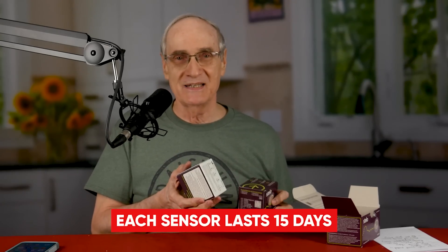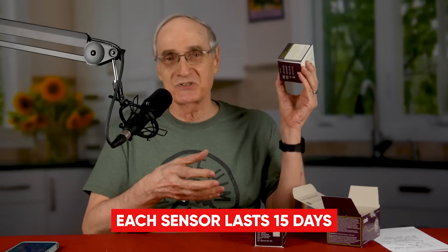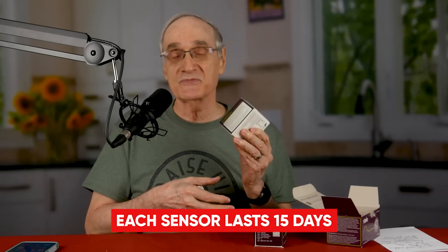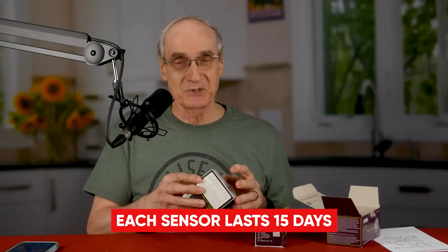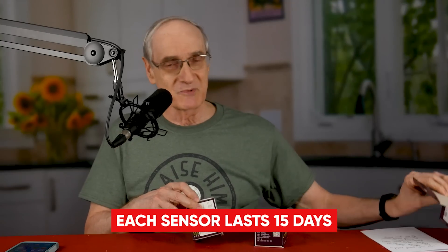I'll admit I'm kind of nervous, and for financial reasons. These two sensors and applicators cost $100 — a little over $100 once you add the tax. So if I mess up and it doesn't work or doesn't stick, I've just lost $50. I don't mind telling you, I prayed and asked the Lord to help me before I got started, because who wants to throw away $50?